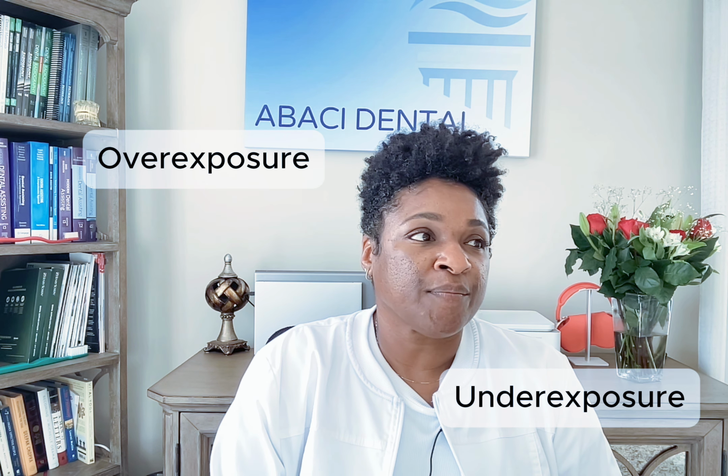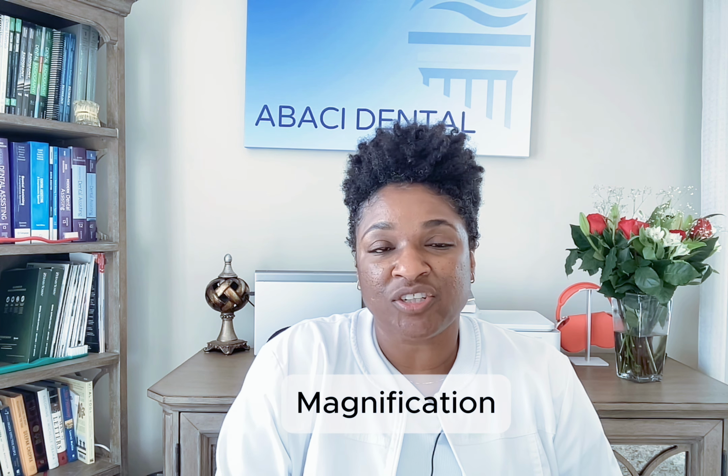So that's just an overview of a few of the errors that you will encounter when taking a dental radiograph and what will be covered on the DANB RHS exam. There are other errors that you will encounter as well, such as overexposure, underexposure. You also have things such as penumbra, magnification, distortion, things like that. And you need to know what those look like as well on a dental radiograph. But the most common errors that you're going to run into will be the ones that were discussed in this video.